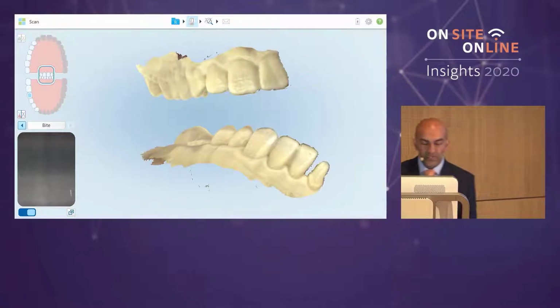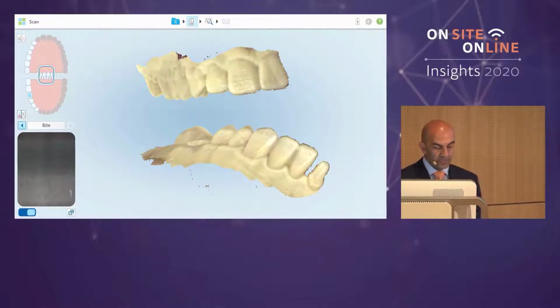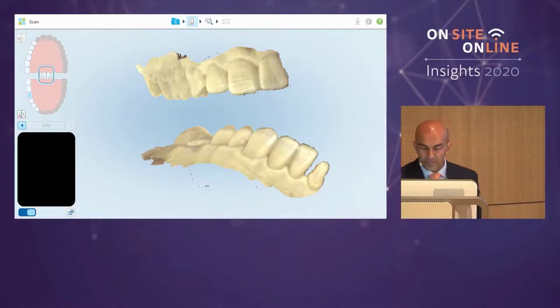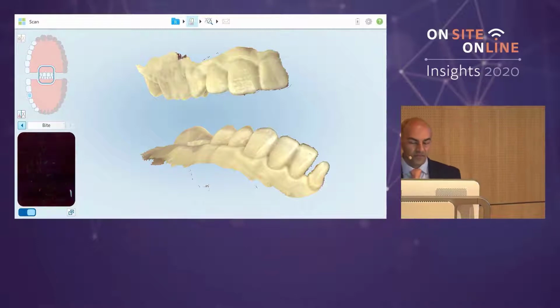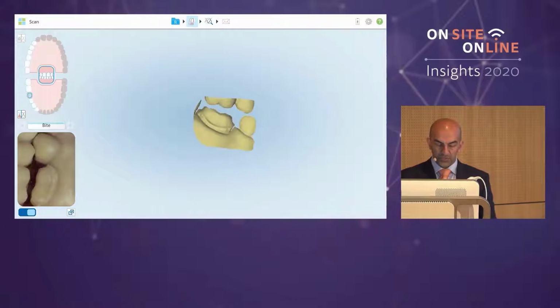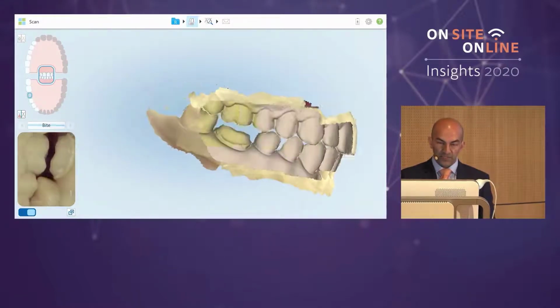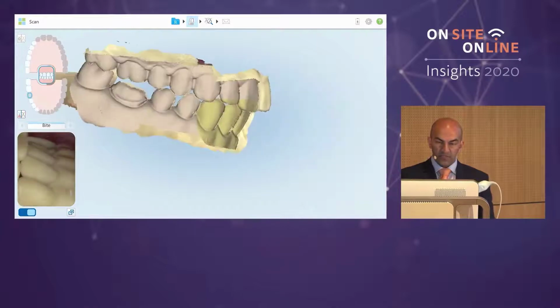From a clinical point of view here, it's really important that the patient bites on their back teeth. Many problems over the years where patients think that they're helping you because you're about to put something in their mouth, so they think that they should open. They shouldn't. They should be closed, and they should be quite tightly closed. Simple things like that help you to ensure that the occlusion is correct and you don't have lots of adjustments to do when you're ready to fit your restoration.